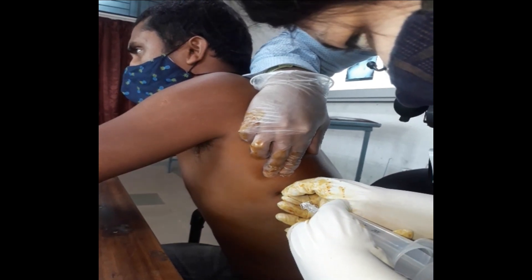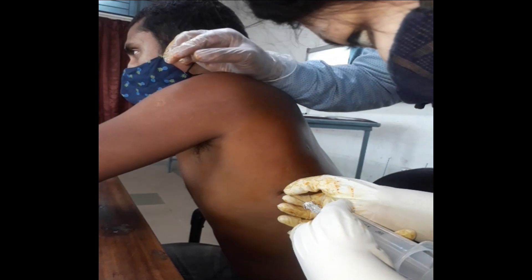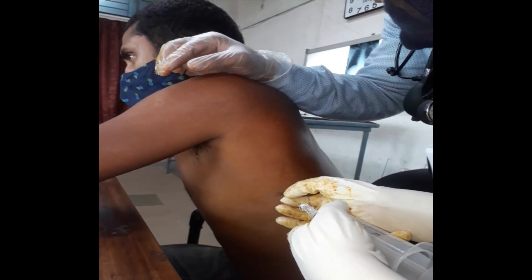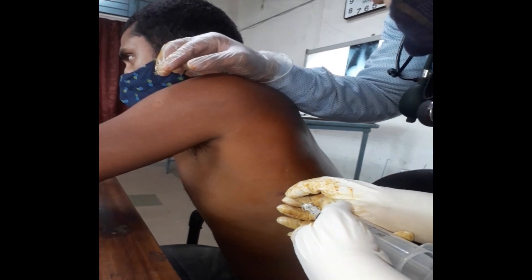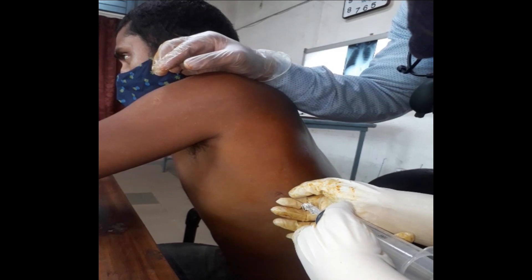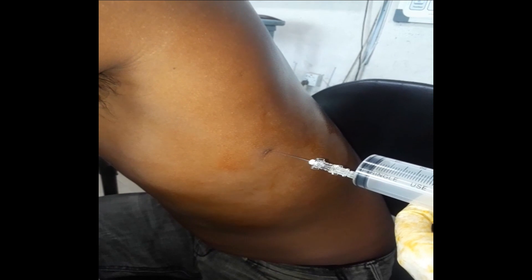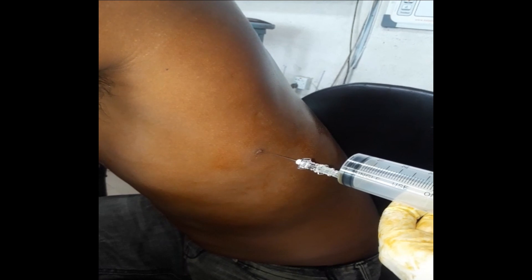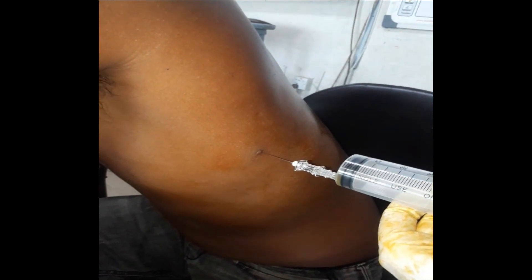If you feel resistance, withdraw the needle — that means it is approaching the bone. When there is no resistance or less resistance, draw the piston. When there is no resistance, draw the piston and see if fluid is coming. If fluid is coming, maintain the negative pressure and draw the fluid.